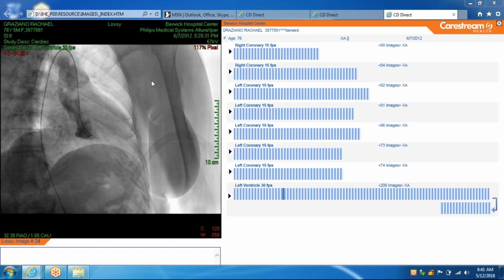The patient can walk around as opposed to when you do the femoral approach, where the patient has to lie flat for a few hours. They can't move, and you're going to limit their walking because if you use a plug, an Angio-Seal, you don't want them to dislodge it, and they can get bleeding, hematoma.